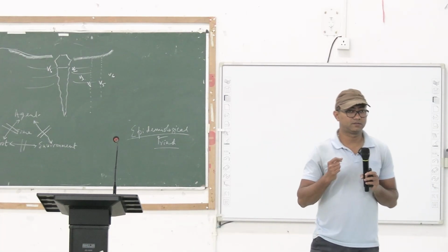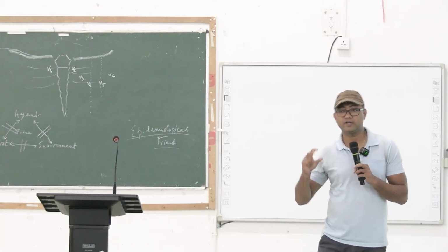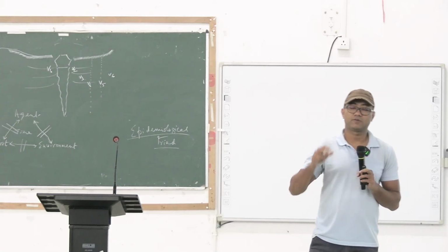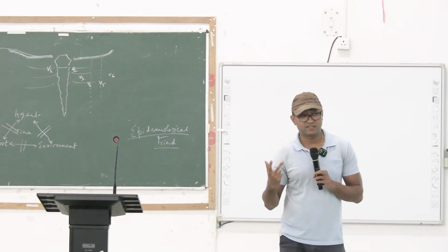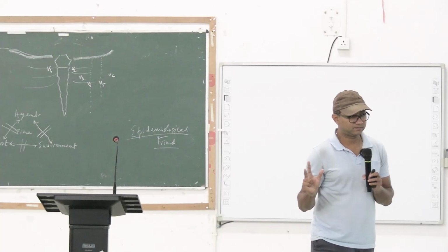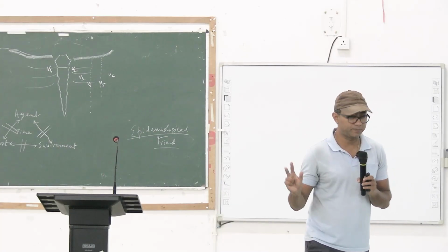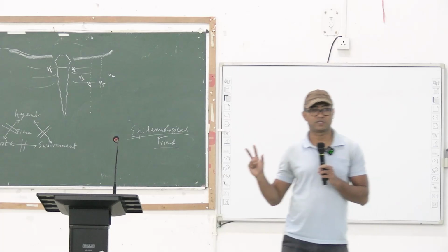Very often a question is asked during your viva examination: why are chest leads called unipolar leads? So, first you need to tell in answer that this is a misnomer. Leads are not unipolar. This is a misnomer.